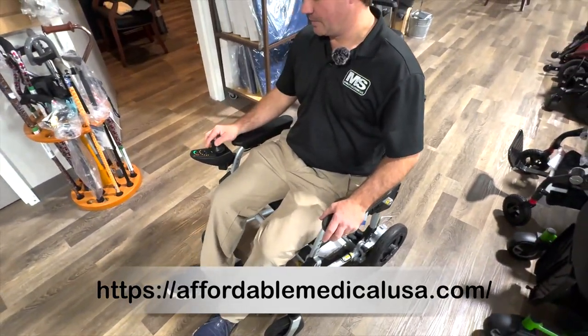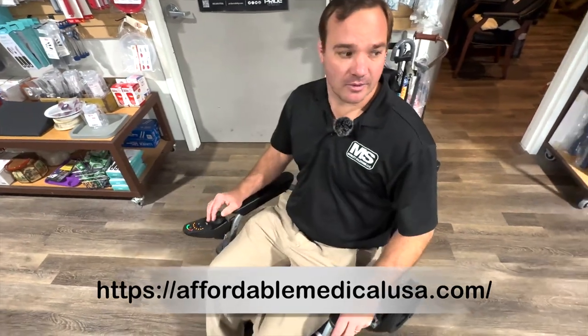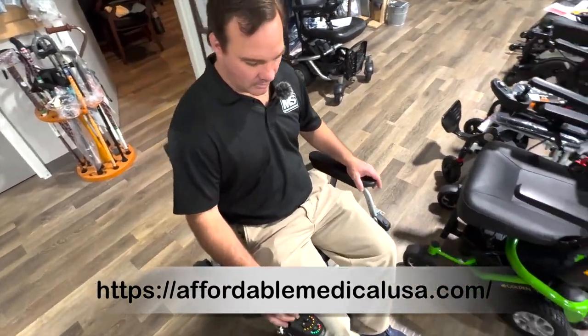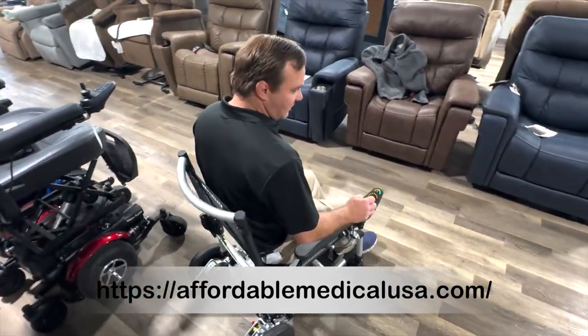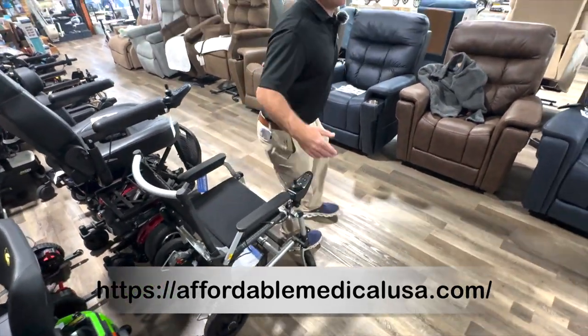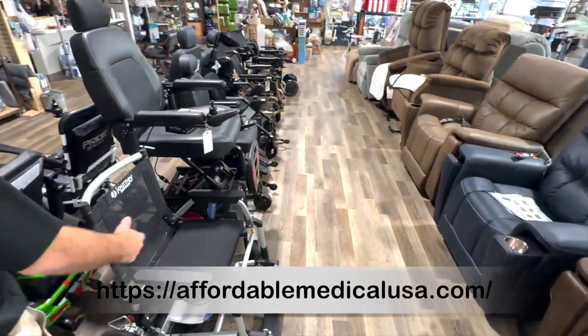Speed controls — take off with it. It's a little bit louder than the other ones but I do like it. So that's the Zoomer. It gives you an extra step, and if you can do that you don't have to bend over too much, but you do.